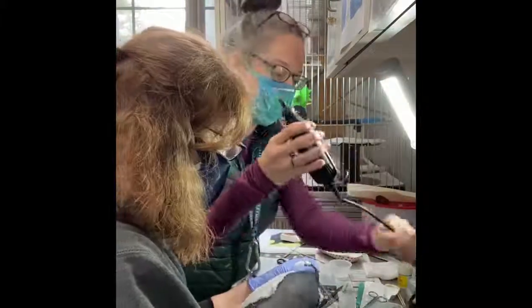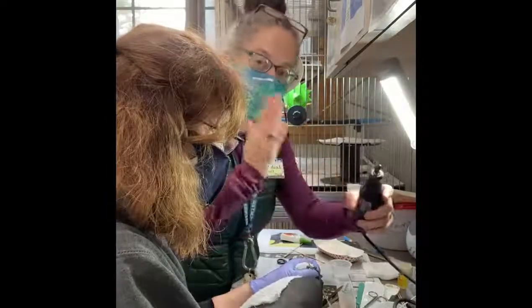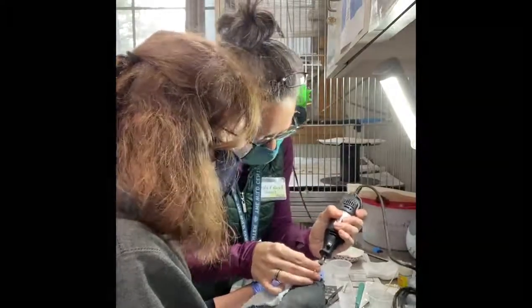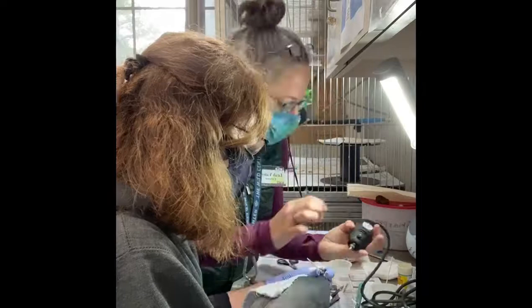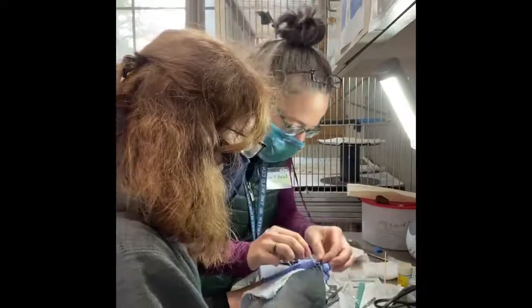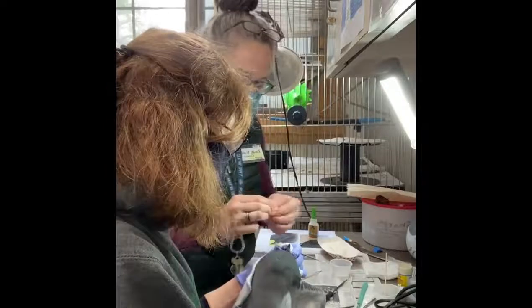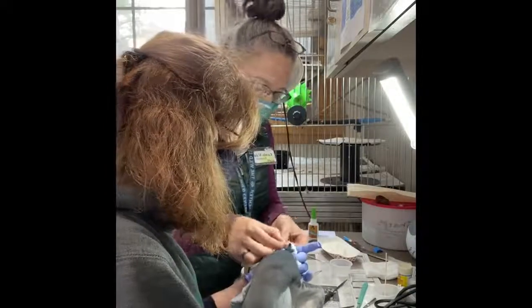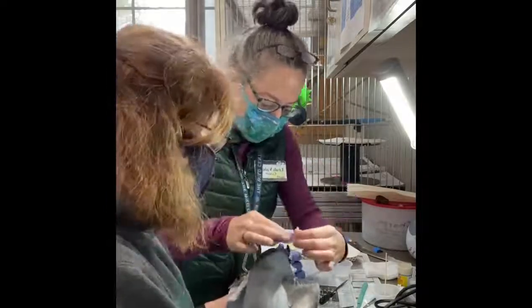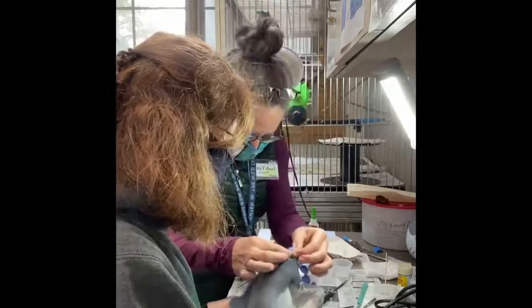Now I'm going to use a Dremel tool — most of you probably know what a Dremel is — with a small tip on it, and I'm going to try to just shave that beak a little bit more. I think this piece is like the perfect size. Let's just see if this fits on there. It's a little bit stretchy — I think I can hold it.